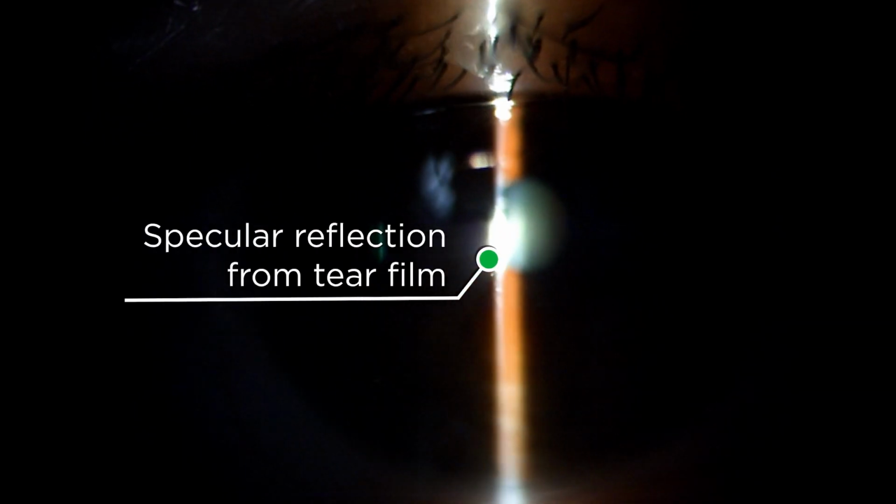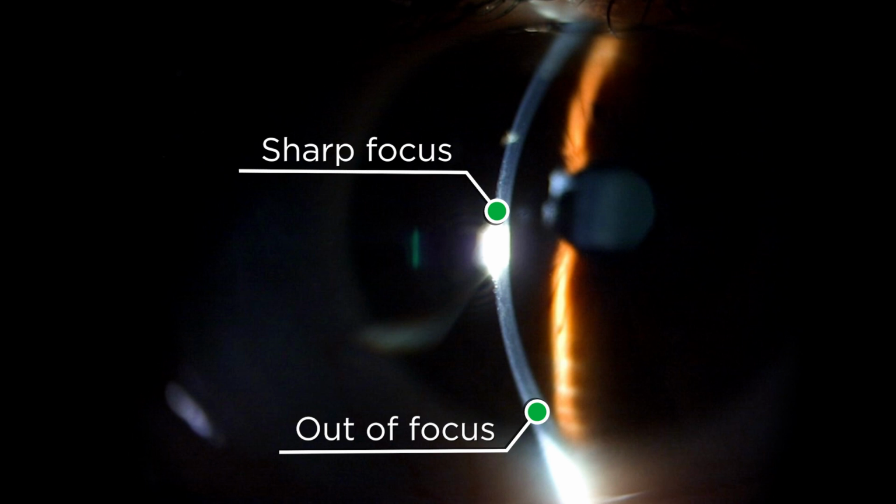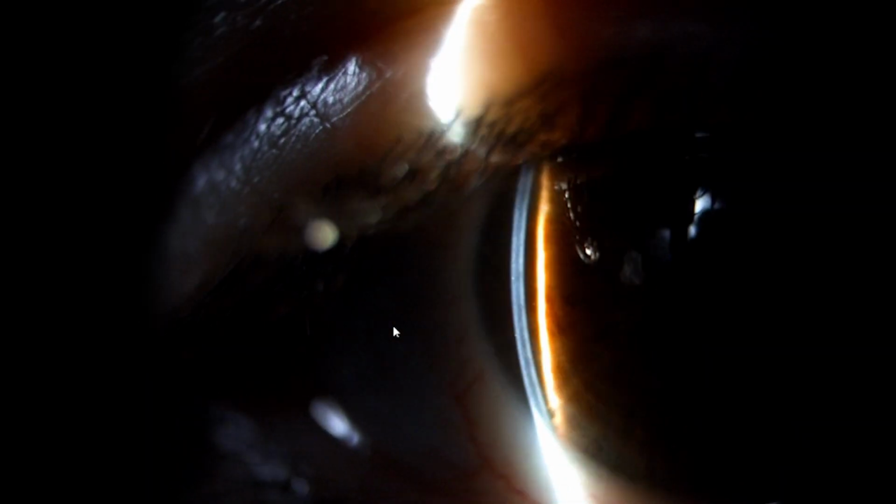When the illumination and observation systems are positioned such that the angle of incidence equals the angle of reflection, the bright reflection of the light source off the tear film is seen on the front of the optic section. To be clinically useful, the level of clarity seen here needs to be maintained as the slit lamp is maneuvered to examine all parts of the cornea. Notice that because of the curvature of the cornea, when the central portion of the optic section is sharply in focus, the upper and lower parts are slightly out of focus. Once you have scanned the central cornea, you'll need to additionally scan the inferior and superior portions to be certain you have not missed any important clinical findings.